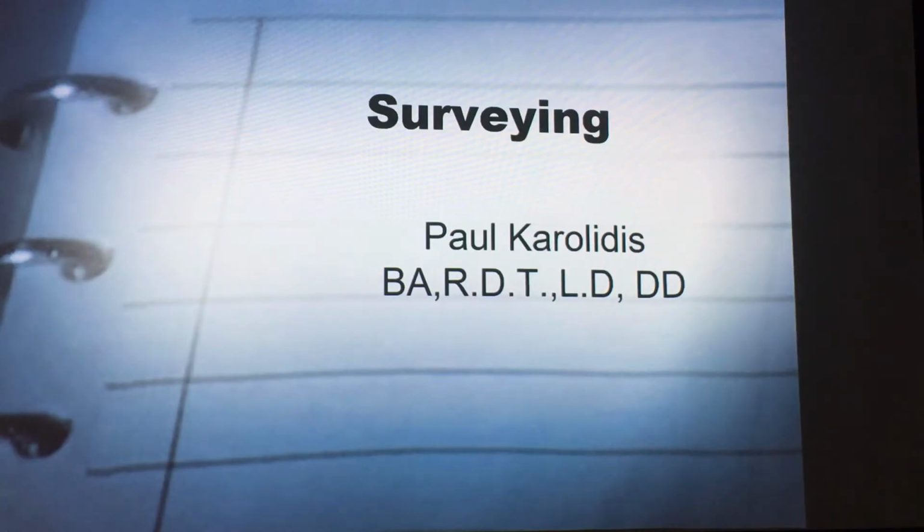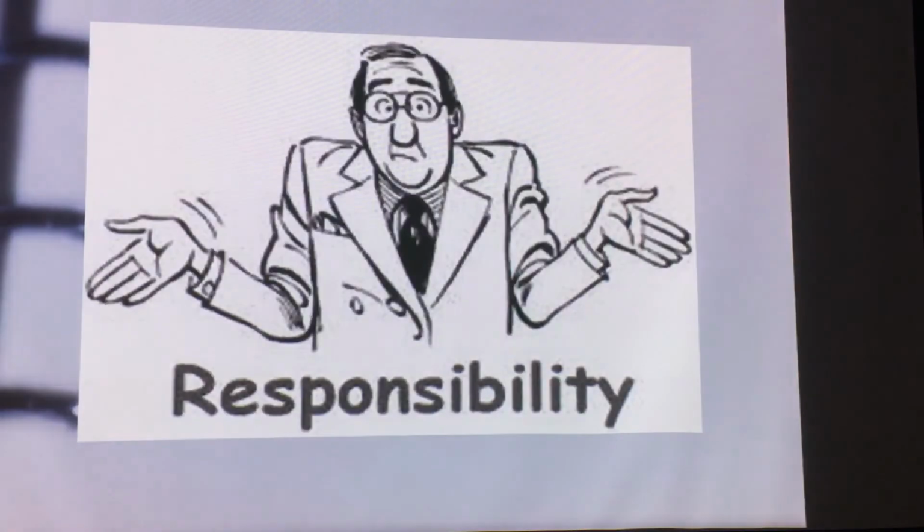But before we get started, we need to talk about the purposes of surveying and what it is we're actually trying to do. Well, I can start off with whose responsibility is it? It's kind of a heavy word. But generally, in my generation, it would be the dentist's responsibility to survey the case. But these days, the laboratories are working up the treatment plan for the dental offices, surveying the models, dictating the path of placement, and then communicating this to the practitioners.